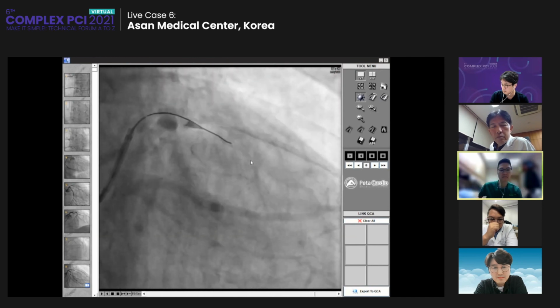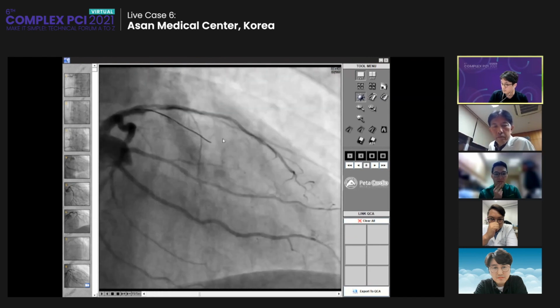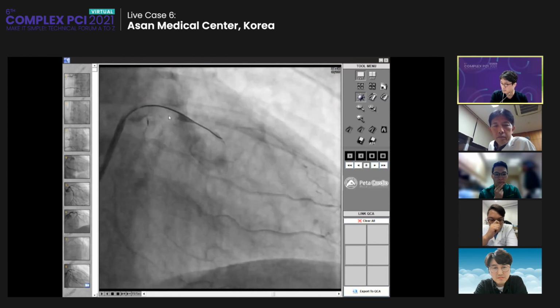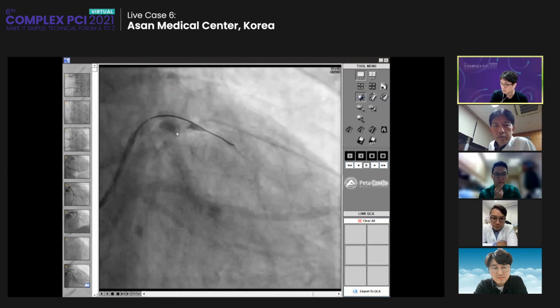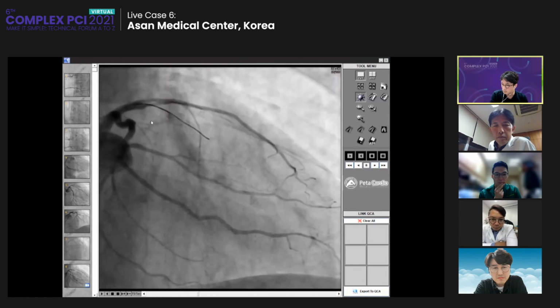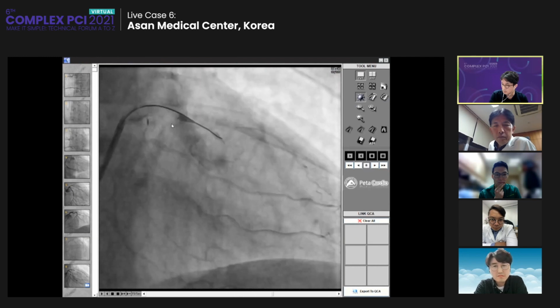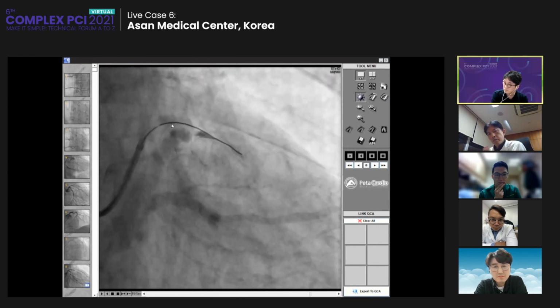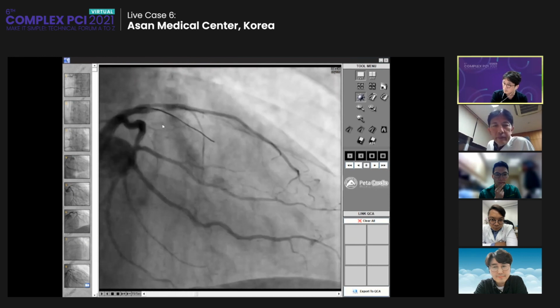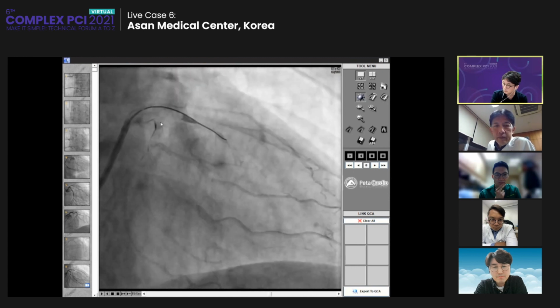We always have to be aware of the wire being in the extraplaque space, because the initial portion of the wire is located at the greater curvature portion. So there are two possibilities. According to our assessment from our angiogram and CT, the wire should be at the mid portion of the CTO proximal cap, which is the ideal portion.